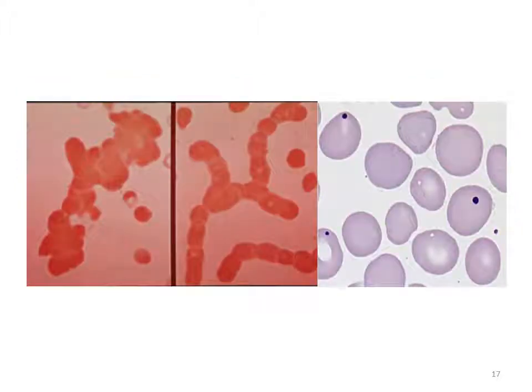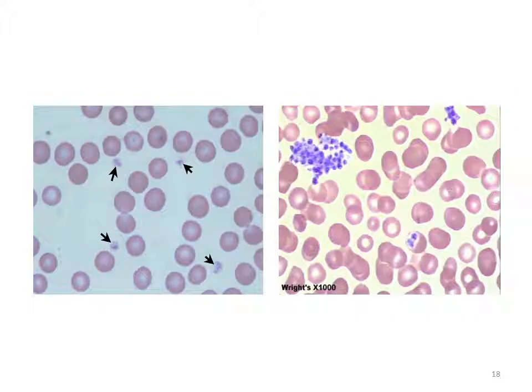Next, under the 100 power lens, scan for red blood cell agglutination, which appears as clumps of red blood cells in the slide on the left, and rouleaux, which have a stack of coins appearance in the middle slide, and look for red blood cell inclusions. The purple dots are Howell-Jolly bodies in the red blood cells in the slide on the right. Finally, under the 100 power lens, assess the platelet morphology and platelet estimate.